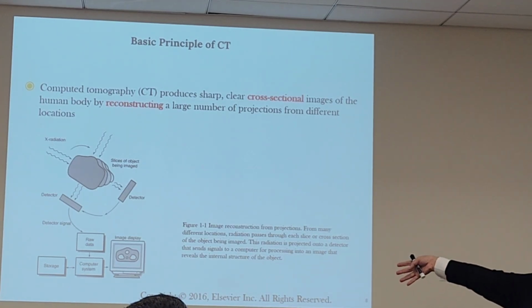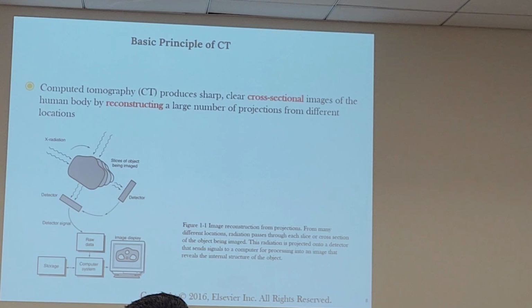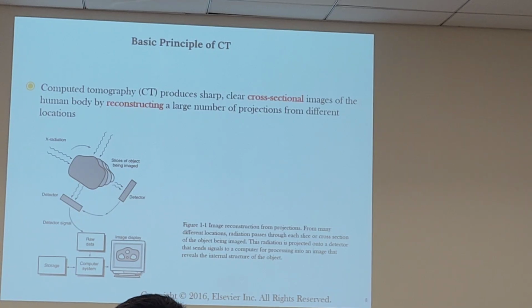Cormack has contributed to providing what for CT's evolution? Math. And then Hounsfield has contributed to what? Clinical use. The founder of CT, but what did he do to make him the founder of CT? And the clinical, he brought it to this industry, okay?